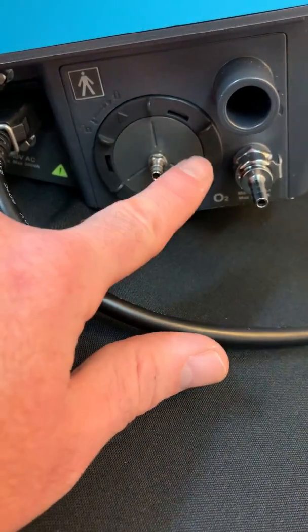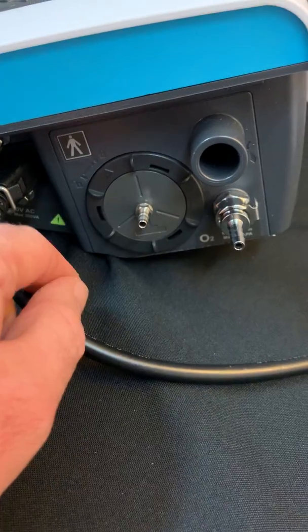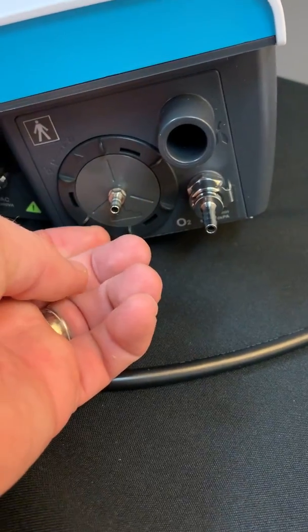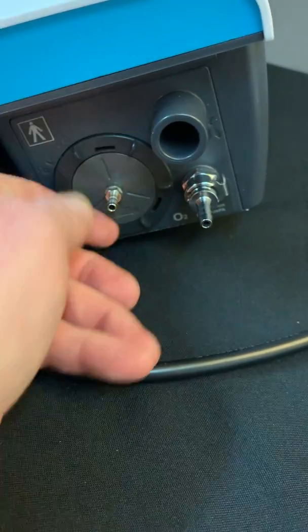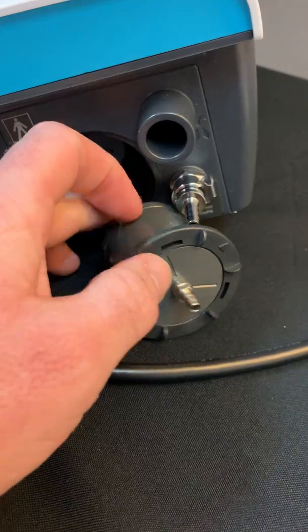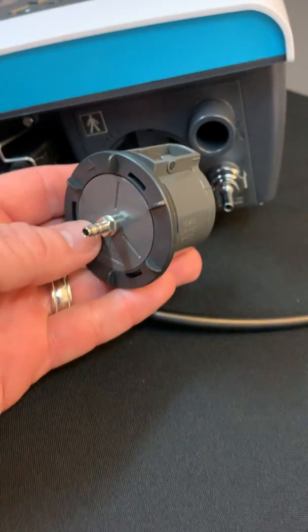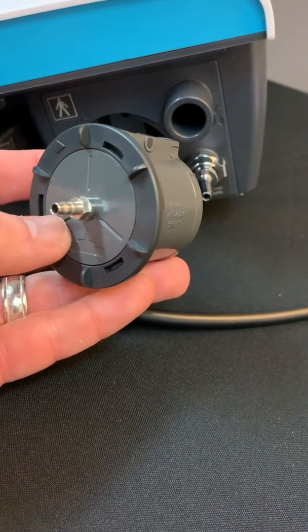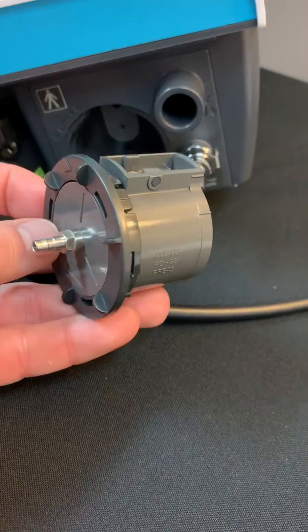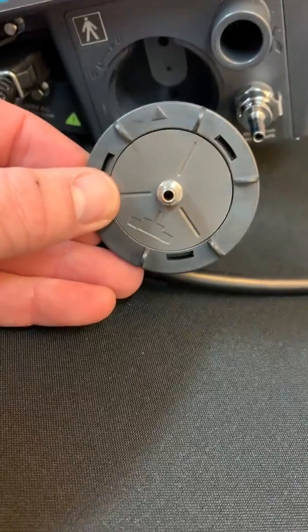Moving over briefly, this section contains our valve inserts. The way I have the device set up currently is for a single limb circuit. To remove the inserts, you just simply unlock the insert like so. This is the single limb insert. You're going to use this for either a single limb active exhalation valve circuit or a single limb passive circuit. Regardless of the type — passive or active — this is the insert you will use for a single limb circuit.